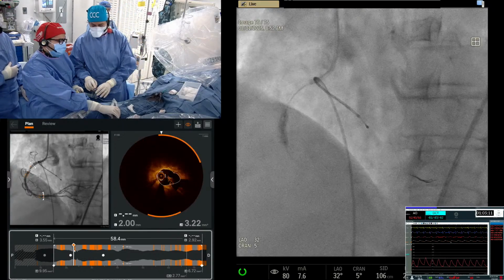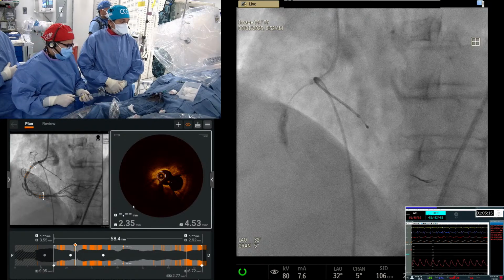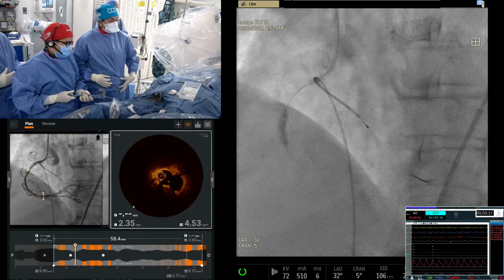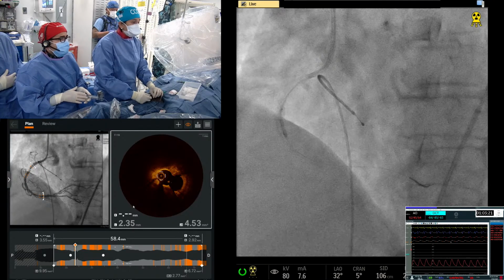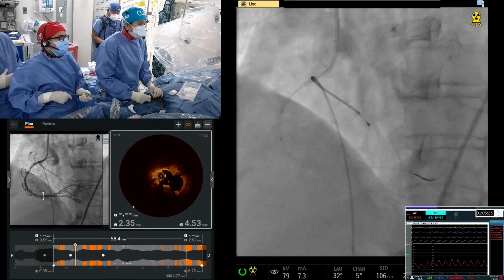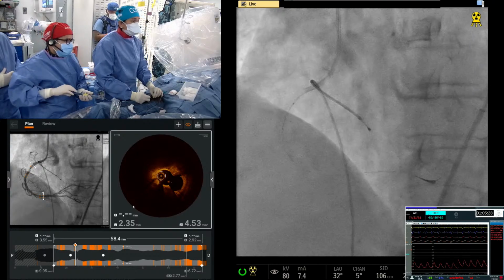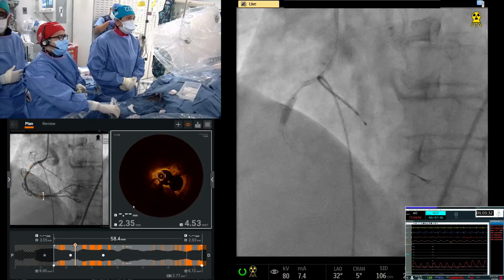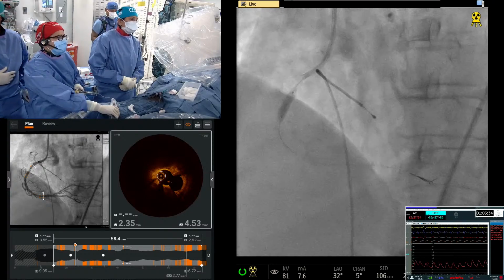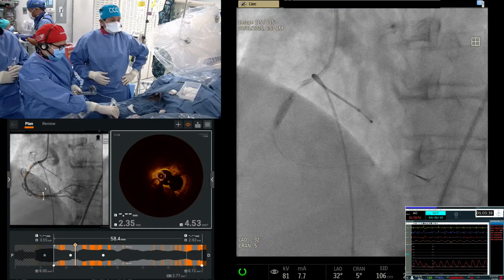This is the kind of case you have to ration. You have to ration your inflations across 3 levels. I know we are at 150 already. We have 5 more left. Okay, somewhere here. So we will need a 48, and that's great. Right, another 18 maybe. What's the length you're getting?